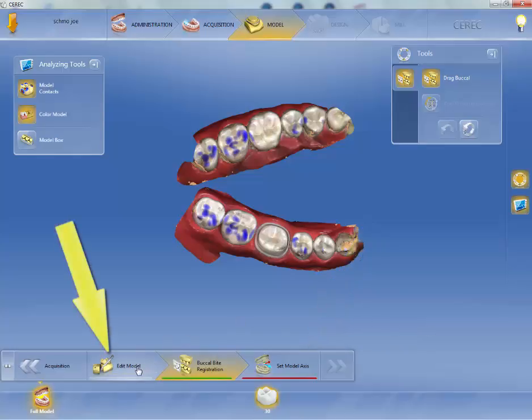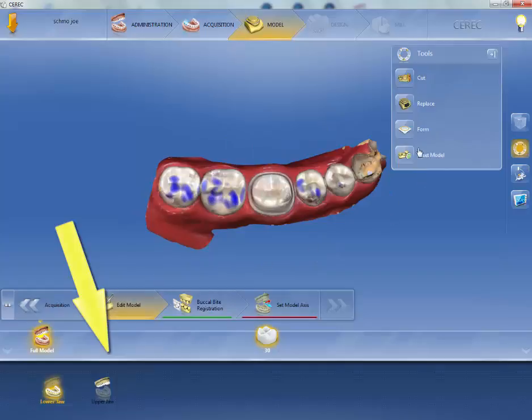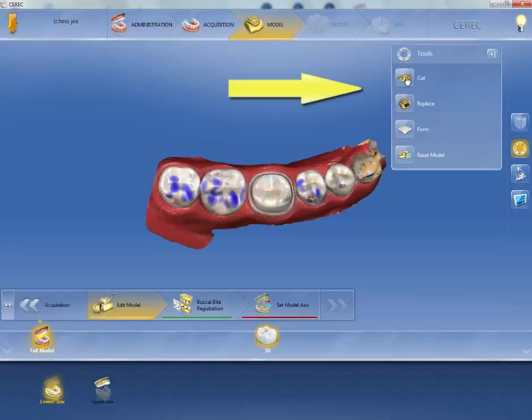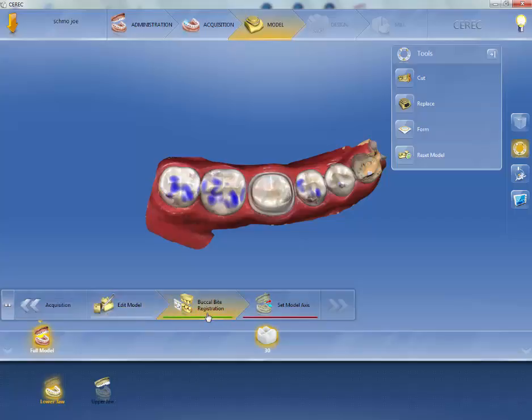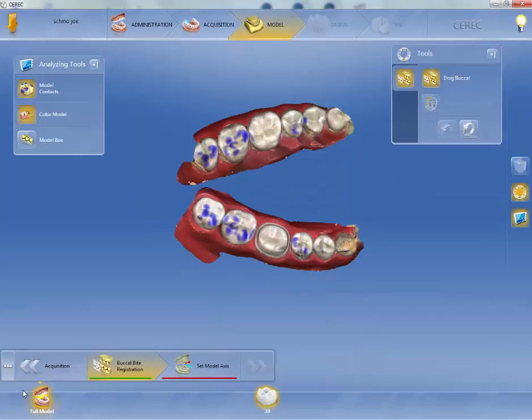Edit Model — I just want to show you this for a moment. What Edit Model does is it allows you to use these tools: the Cut Tool, Replace Tool, Form Tool, and Reset Model. The problem is that if you were to go in, say with the Form Tool, and change something on your preparation, then your restoration will not fit. I normally recommend you just don't go into Edit Models. To hide it, look at the bottom of the bar — anytime there are a few dots, if you left-click on that dot, it will hide it. So I would advise you to go ahead and hide that so you don't get confused and end up using it.